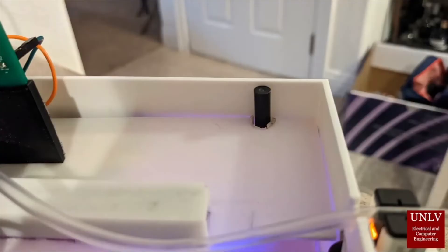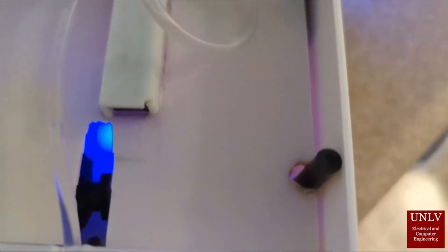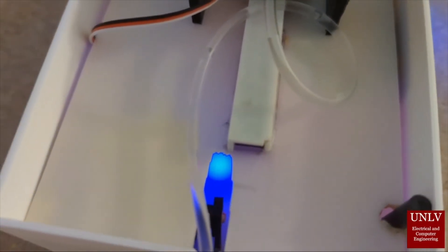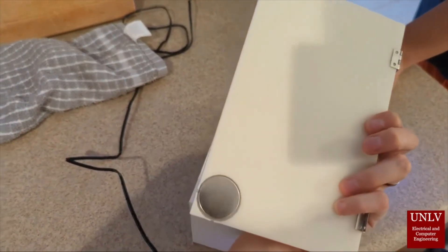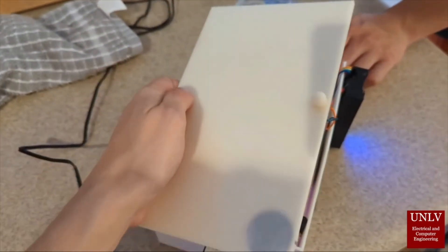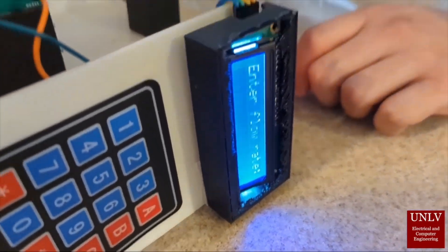That is our proximity sensor, which shows when the door is closed. We want to make sure that the device only proceeds when the door is shut, so that everything inside the device is secure. Once the door is closed, you can enter the flow rate.